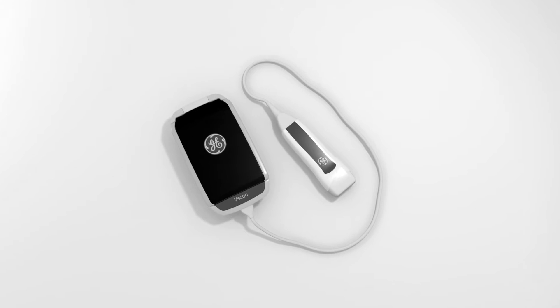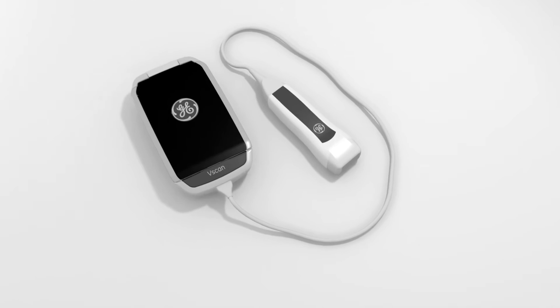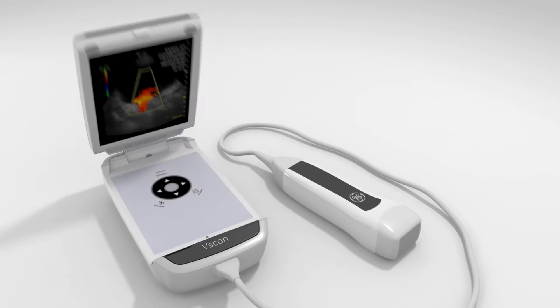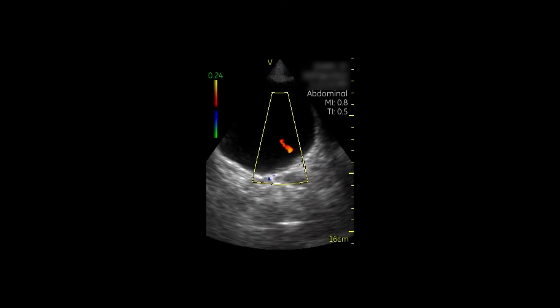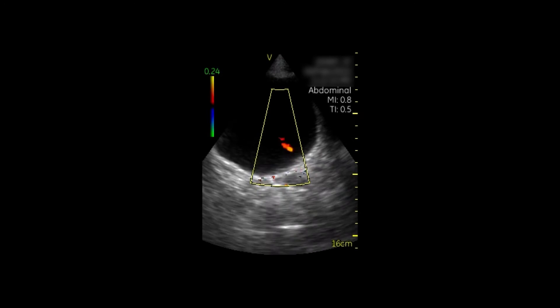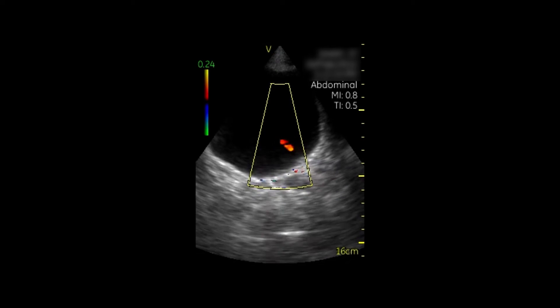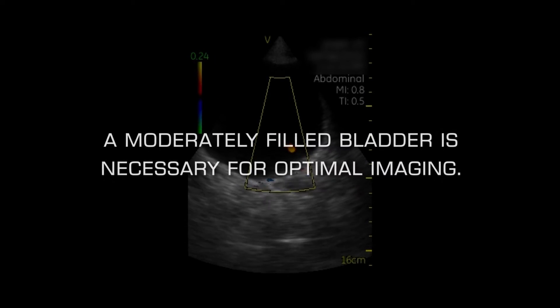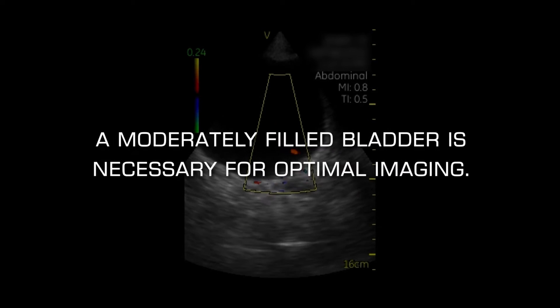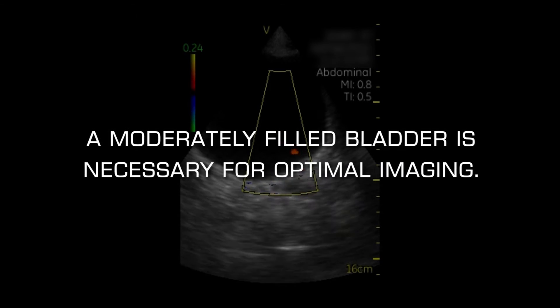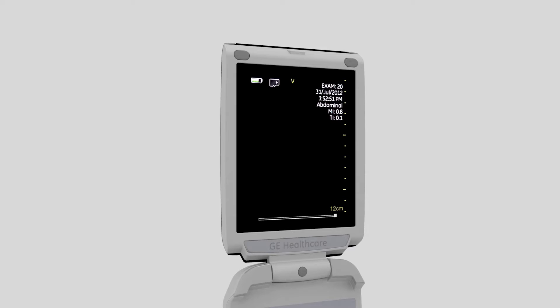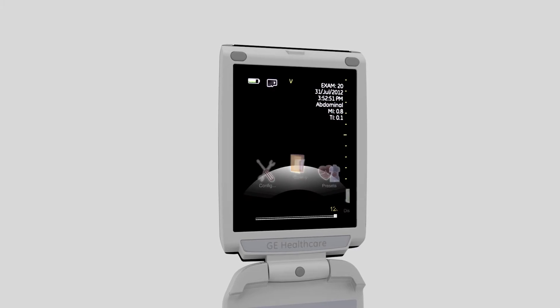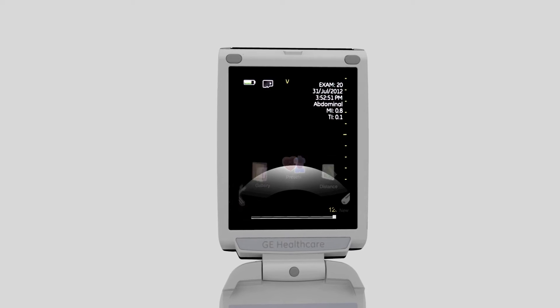The vScan ultrasound device can be used during the evaluation of the urinary bladder. A moderately filled bladder is necessary for optimal imaging, so patients should be instructed to hold their urine prior to the exam. The patient should lie supine on the examination table. Select the abdominal preset on the vScan device.